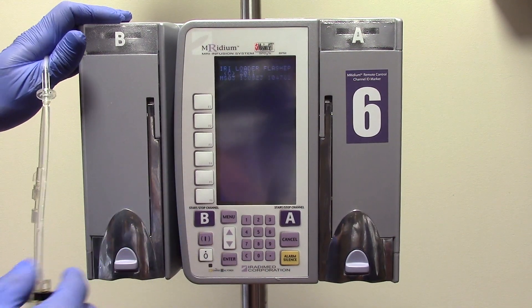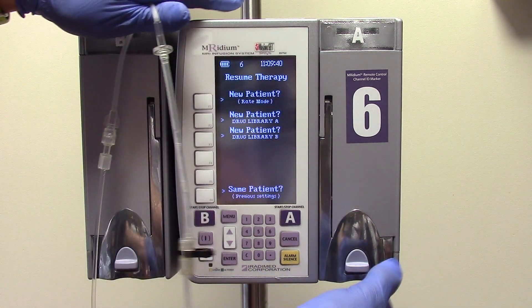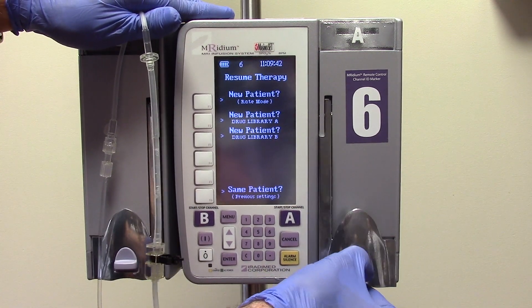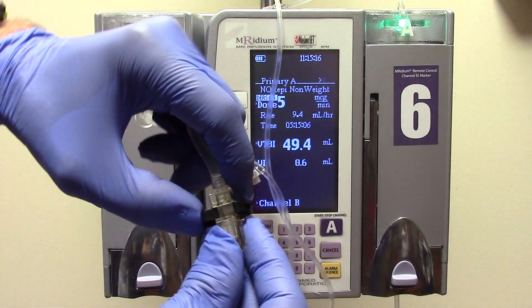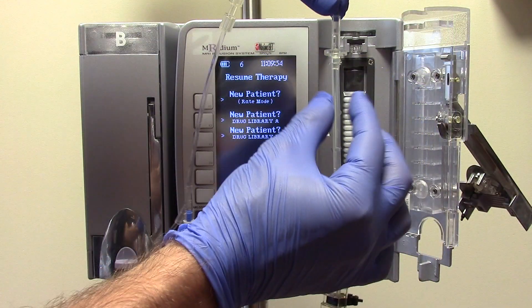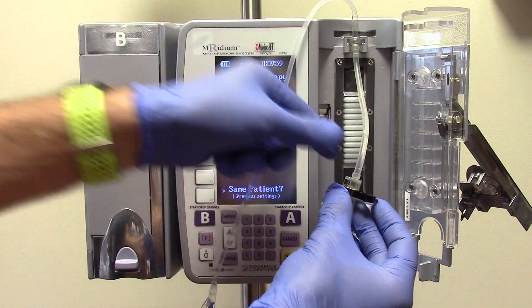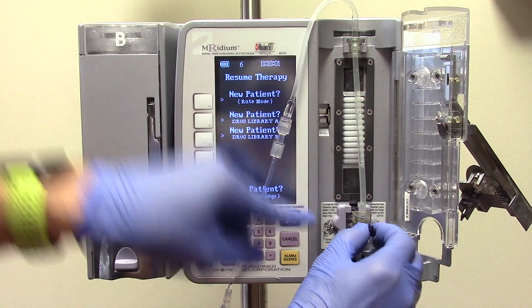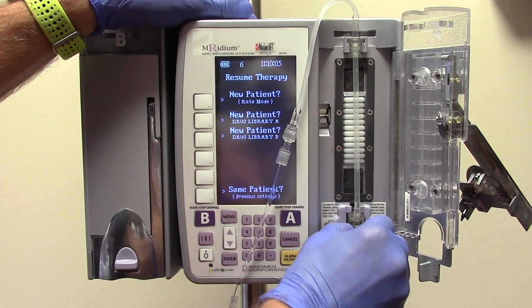Once the extension is primed, load the MRI pump. Turn the MRI pump on and allow it to load. Open channel A by pressing down on the purple button, then pulling up and out. Completely close the black flow preventer by pressing it all the way in. Then insert the IV set disc into the disc slot. While holding the spine of the black flow preventer, push down on the channel lever and push the flow preventer into its slot.